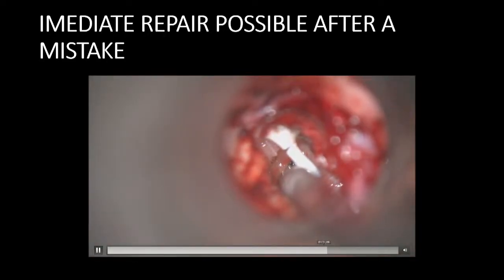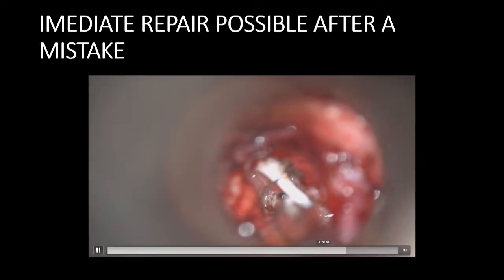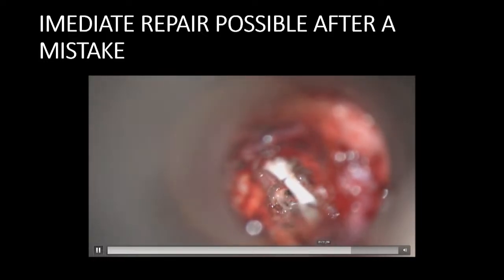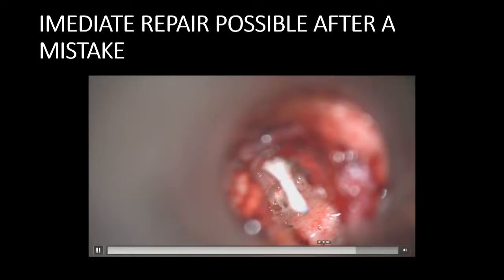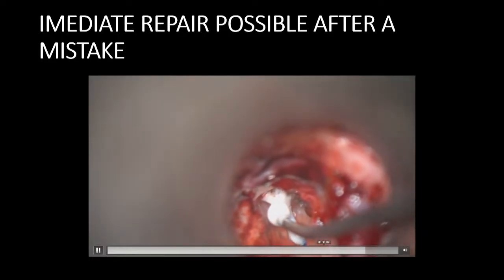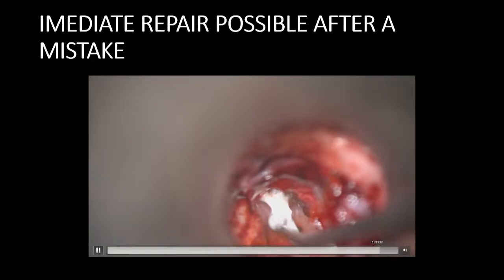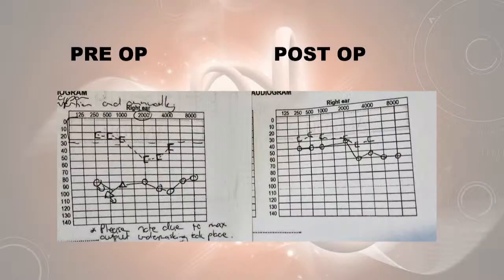And while drilling the stapedotomy, I fractured it. You see here? The nice thing is, because the nylon core was in place, it's not a problem. It's still fine. We were able to carry on with the surgery. Surgery was then continued, and then we just reinforced it at the end of the surgery, and it's strong and doing well. I'm going to move on to the next one. That was a nice result there.